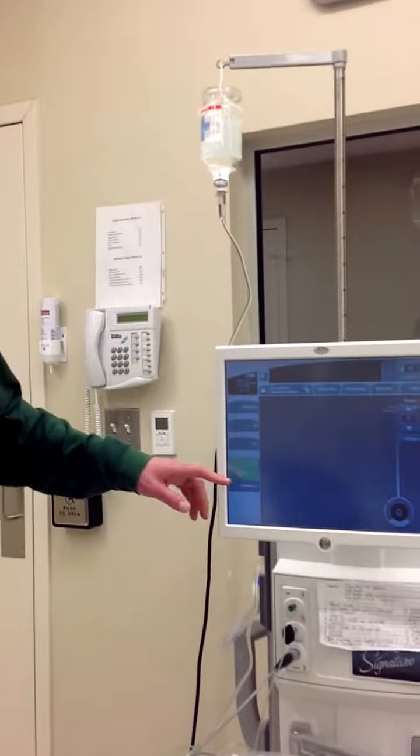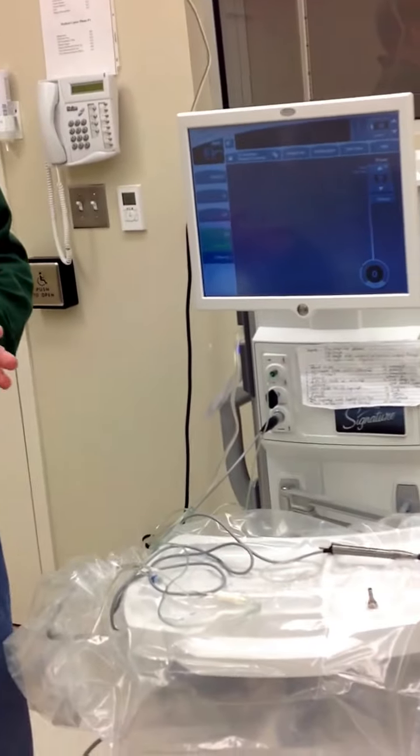So it's just here in case you need it, and with today's surgical practice, most people don't. The most likely use for the cautery on the machine would be a combined trabeculectomy, phaco procedure, where the doctor is playing with the sclera, creating a flap for his trabeculectomy.